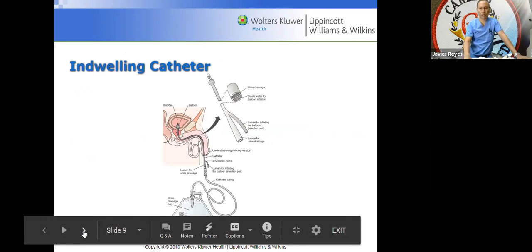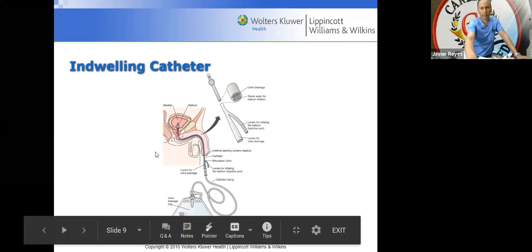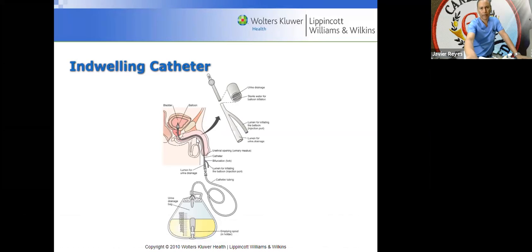And there's that picture that I was trying to show you earlier, okay? You see the way it's inserted into the bladder. You can see this little part right here. This is the prostate, okay? And this is the urethra, where the urine comes out. Well, it's over the prostate. So if this enlarges, it pushes on the urethra and squeezes it, and the male cannot urinate. It becomes very, very difficult.